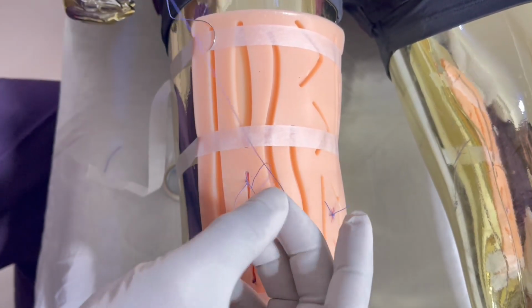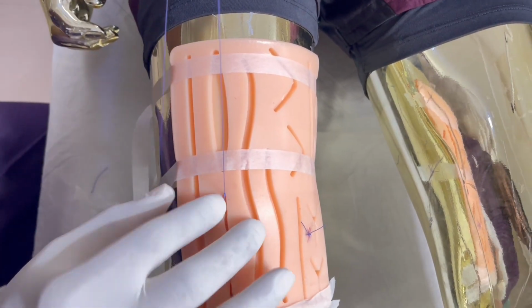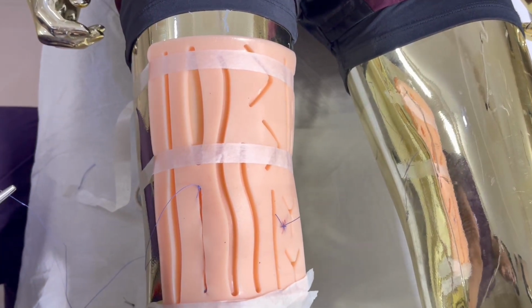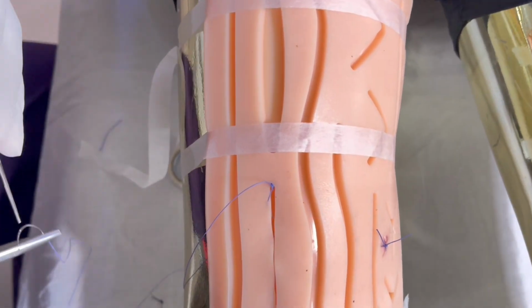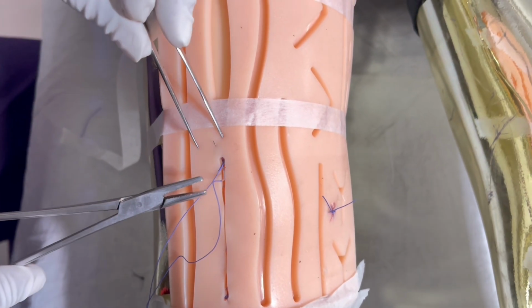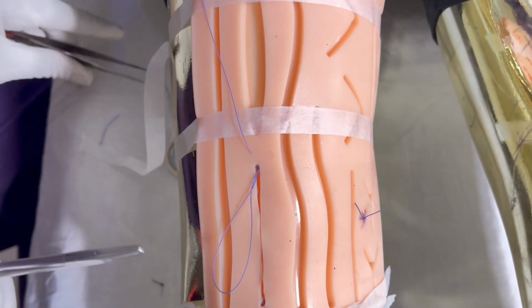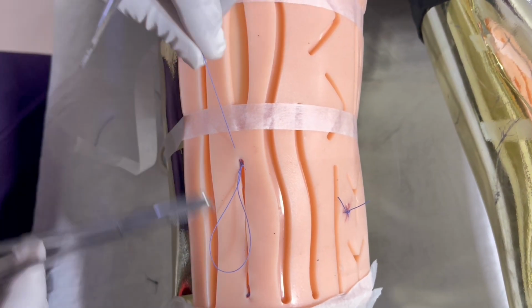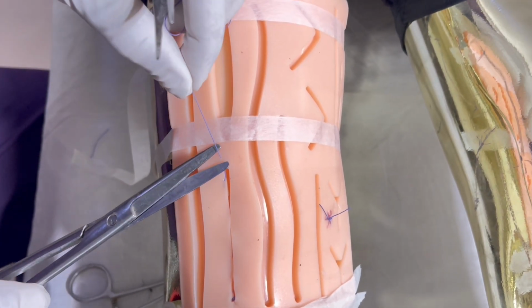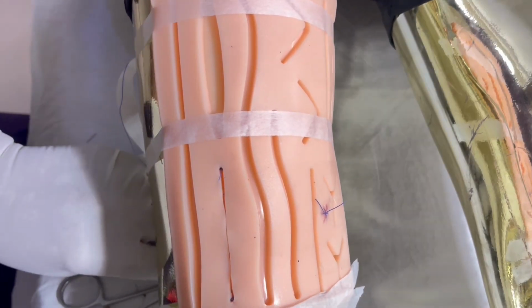Finally, you bring the complete suture material out, and if this knot is still coming out, we can bury this knot. So the last knot can be buried in this manner. So the knot goes inside and you have to give some traction and cut the suture. The suture is going inside and the wound is approximated. So this is continuous suture.